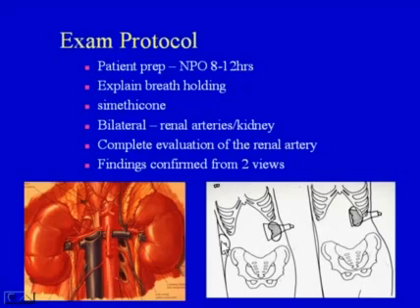It's also helpful to place a pillow under the patient's side that they're lying on, because with the pillow, you can now put the arm above the head and open up and try and move the rib cage away from the kidney.